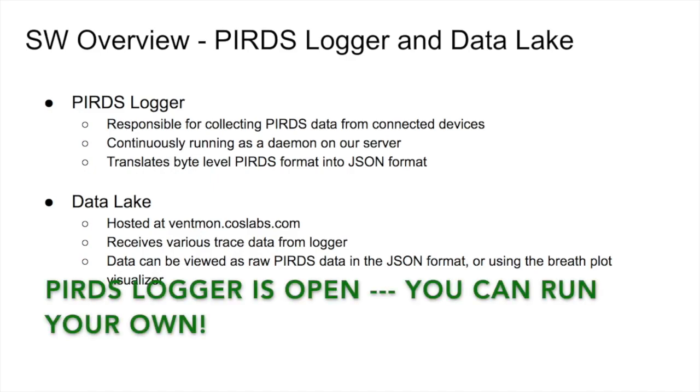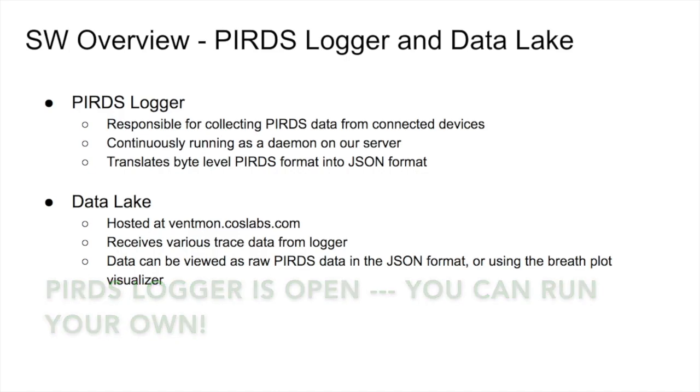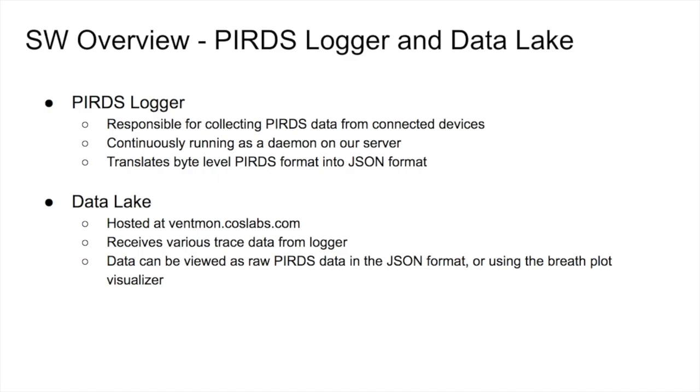So the PIRDS logger is one of the core components of our device, and it's responsible for collecting all of that data from the various VentMons connected. It's continuously running as a daemon on our server, and its main goal is to translate the byte-level PIRDS data into the JSON format for easier processing down the pipeline.